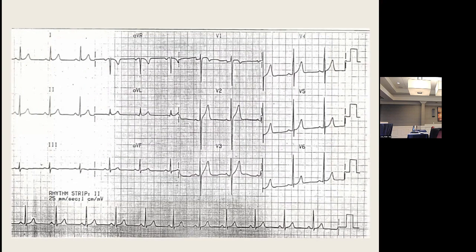You give me a 75-year-old with hyperlipidemia, hypertension, previous history of coronary artery disease, presenting with chest pain, I'm not calling this early repol. I don't care what the morphology of that looks like. This is ST elevation until proven otherwise. So clinical context changed the interpretation here.